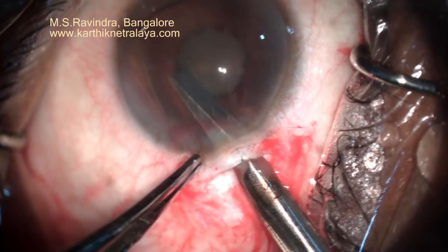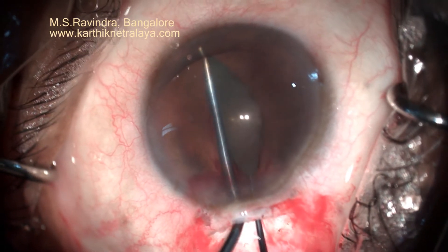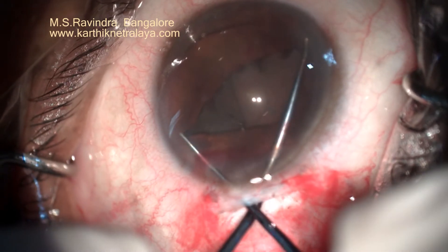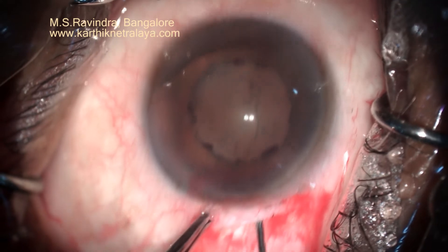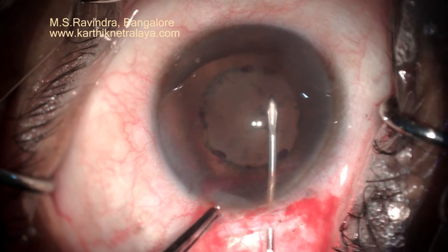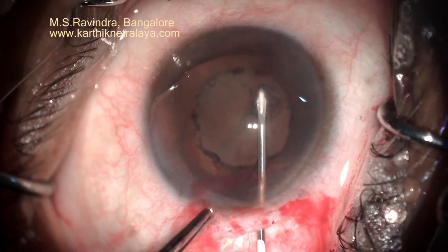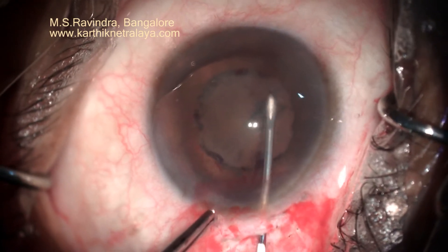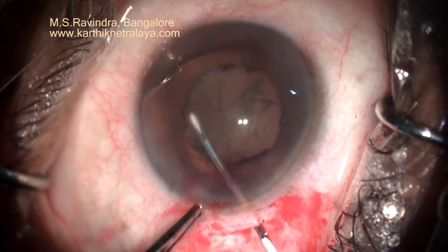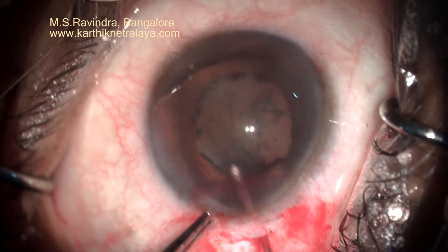You can hold one end of the membrane and support it at the pupil, and pull it in the circumferential direction, but it did not work well in this patient so I had to cut the fibrotic membrane. One wire is engaged at one diameter of the pupil and then the other end is pulled by another instrument to stretch it in two directions — many times one direction is also adequate. Now I have a decent-sized 4 to 5 mm pupillary dilatation.